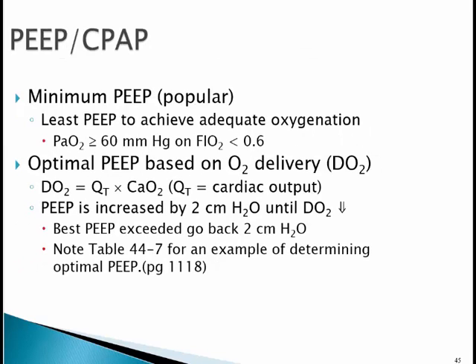In evaluating the PEEP, you want to use as little PEEP as possible to accomplish adequate oxygenation. So what we're trying to accomplish here is at least a PaO2 of greater than 60 on an FiO2 of less than 60. So we adjust the PEEP to where we can accomplish this.